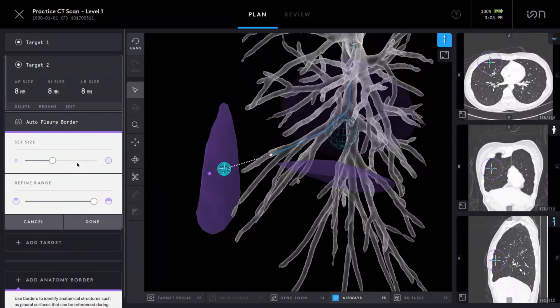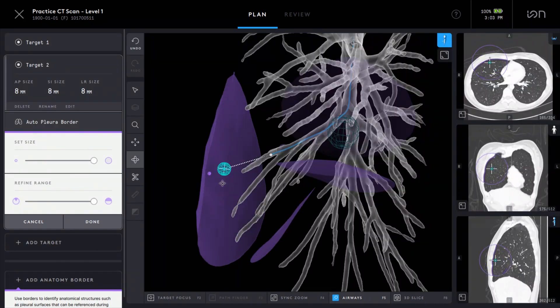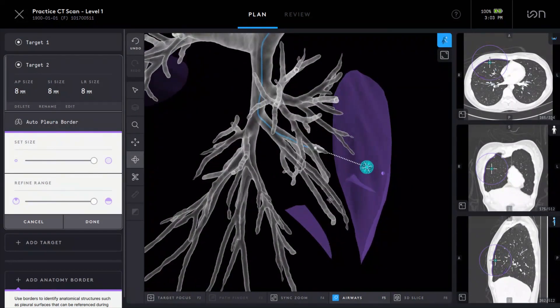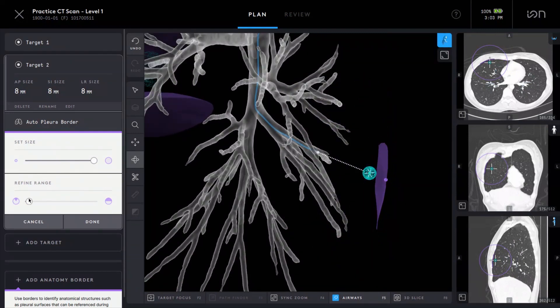The software was also designed with user flexibility in mind. Physicians can adjust the coverage of the automatically provided anatomy borders and create their own borders as they deem necessary.